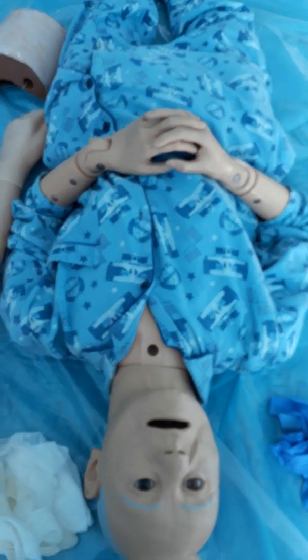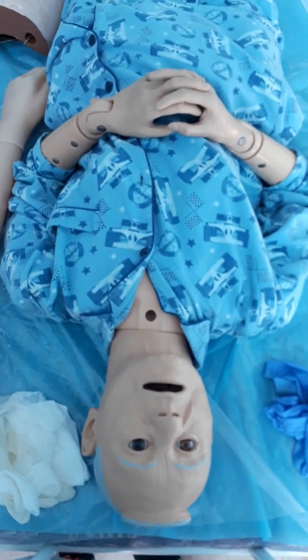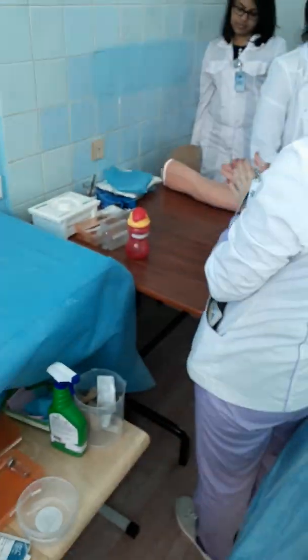Utilize your gloves. Clean your hands and write down in your administration before this, if you did this manipulation.